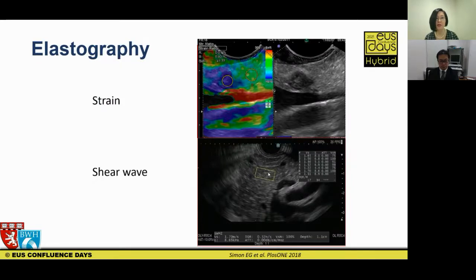And this is showing you, again, an example of strain elastography on the top EUS images. Because of what I referenced earlier with the subjectivity of looking at the various gradations of color, there have been attempts to semi-quantify strain elastography, one example being the strain ratio here.